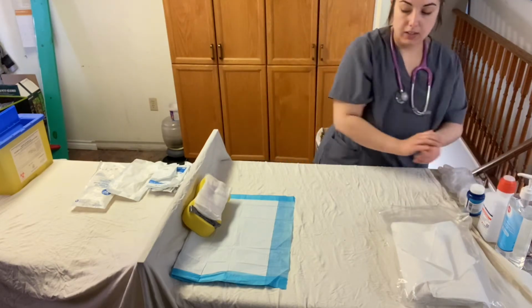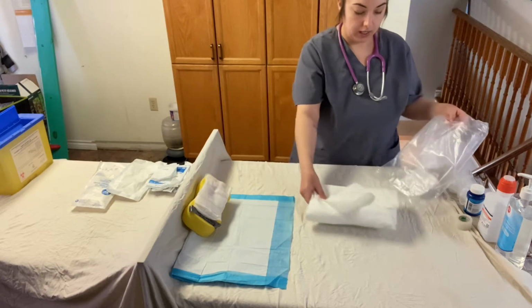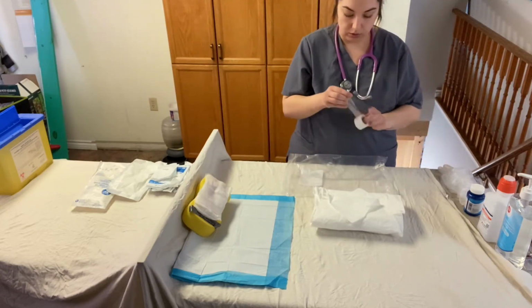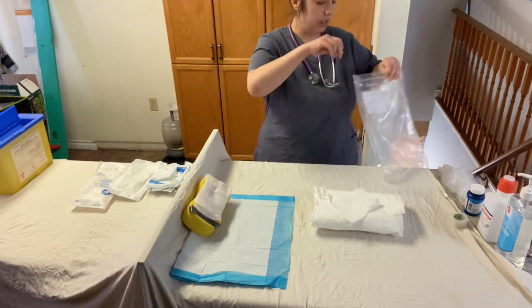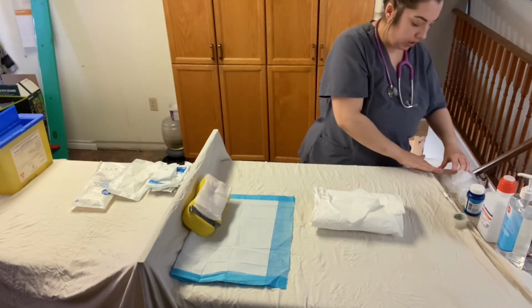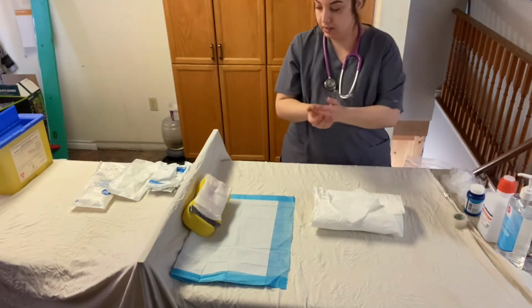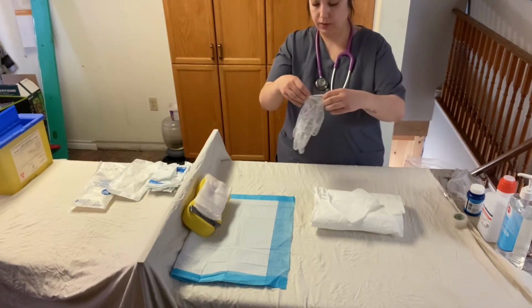I'm going to perform hand hygiene again, and I'm going to take my sterile dressing tray out of its bag. I'm going to tape this bag to the side of my workstation, and I'm going to use it as a garbage during my procedure. So I'm just going to have it at a place that is easily accessible but not within my sterile field. I'm going to perform hand hygiene again, and then I'm going to don a pair of clean gloves.